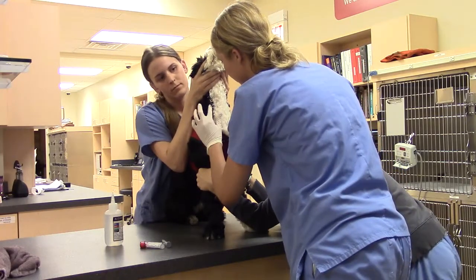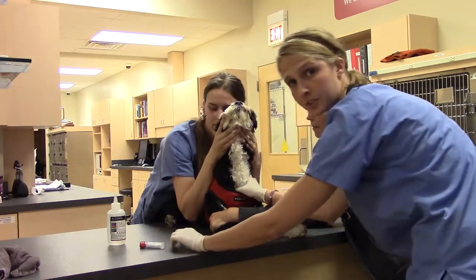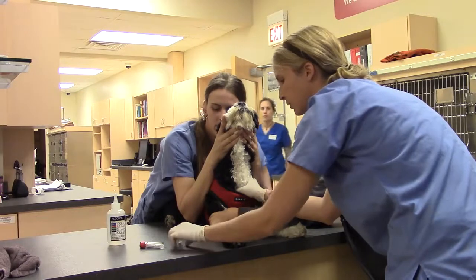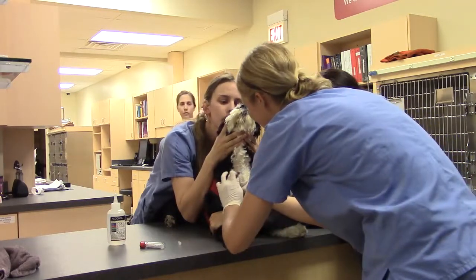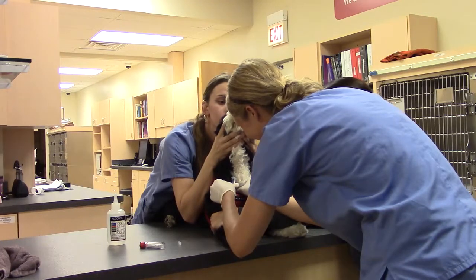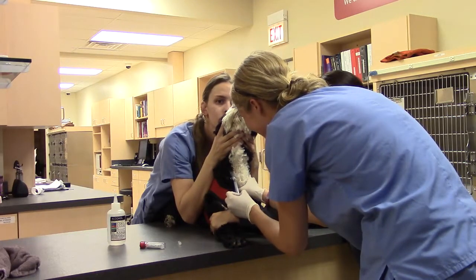So I've palpated it. There's still alcohol in there, so I'm going to go ahead and poke. I'm going to make sure I'm poking with the bevel up. And then we're going to go ahead and pull back.